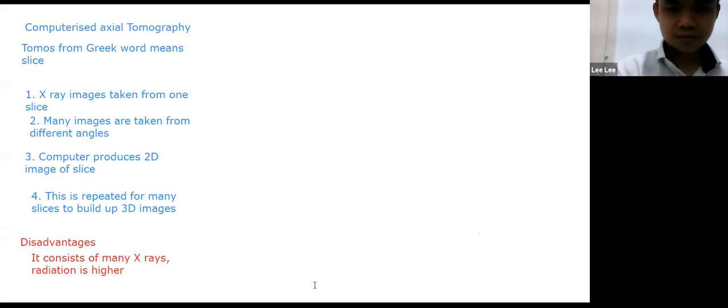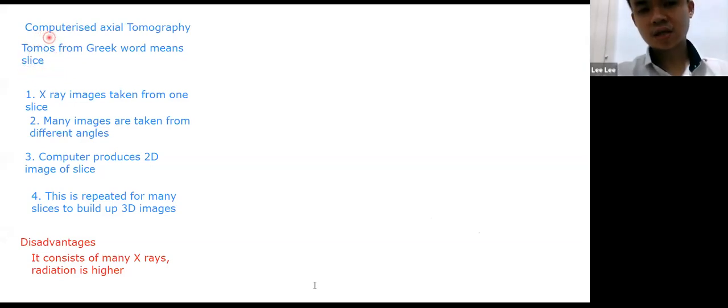So the word tomo itself is coming from tomos. Tomos means slice. So if we are using a CT scan, there are several steps that you will see in a CT scan procedure.